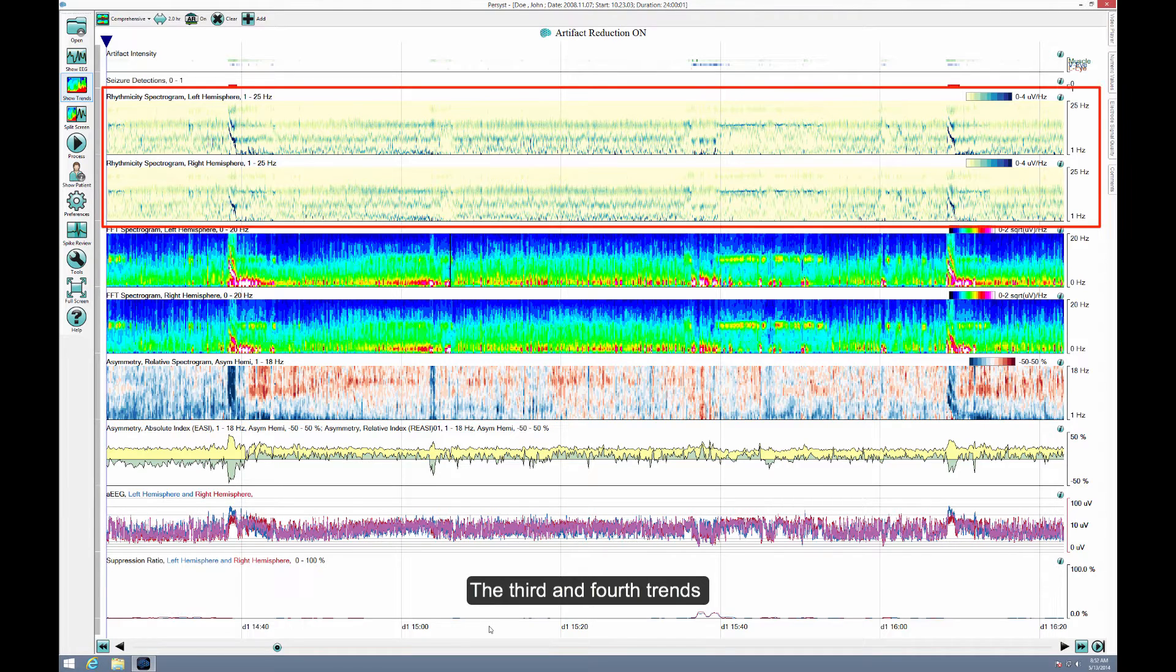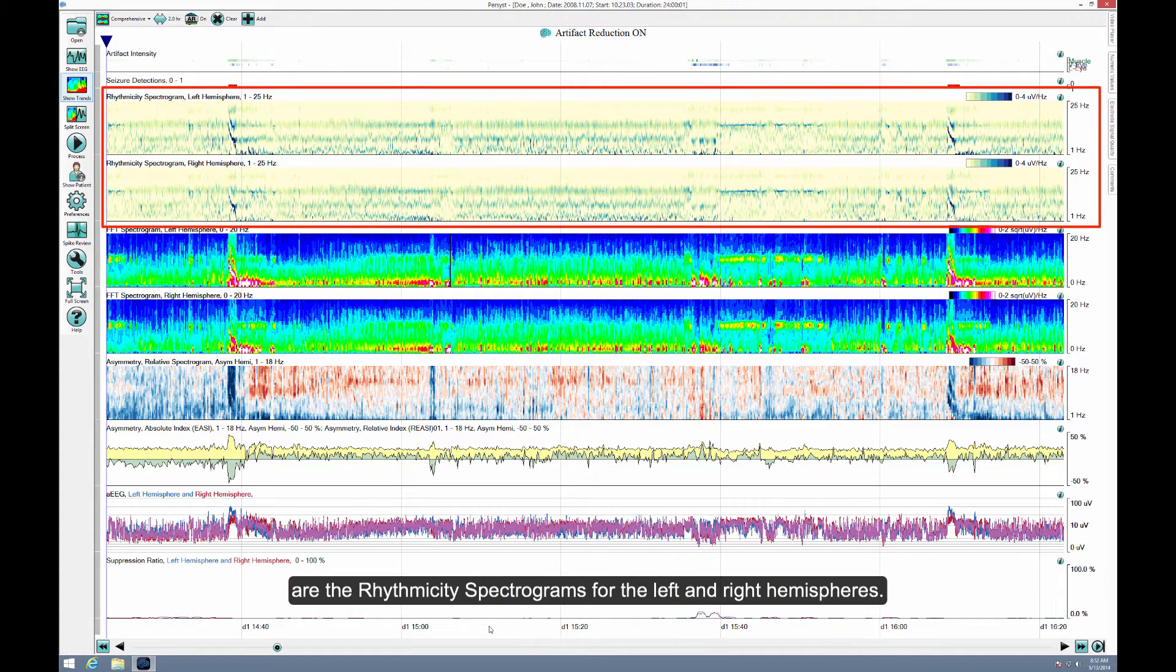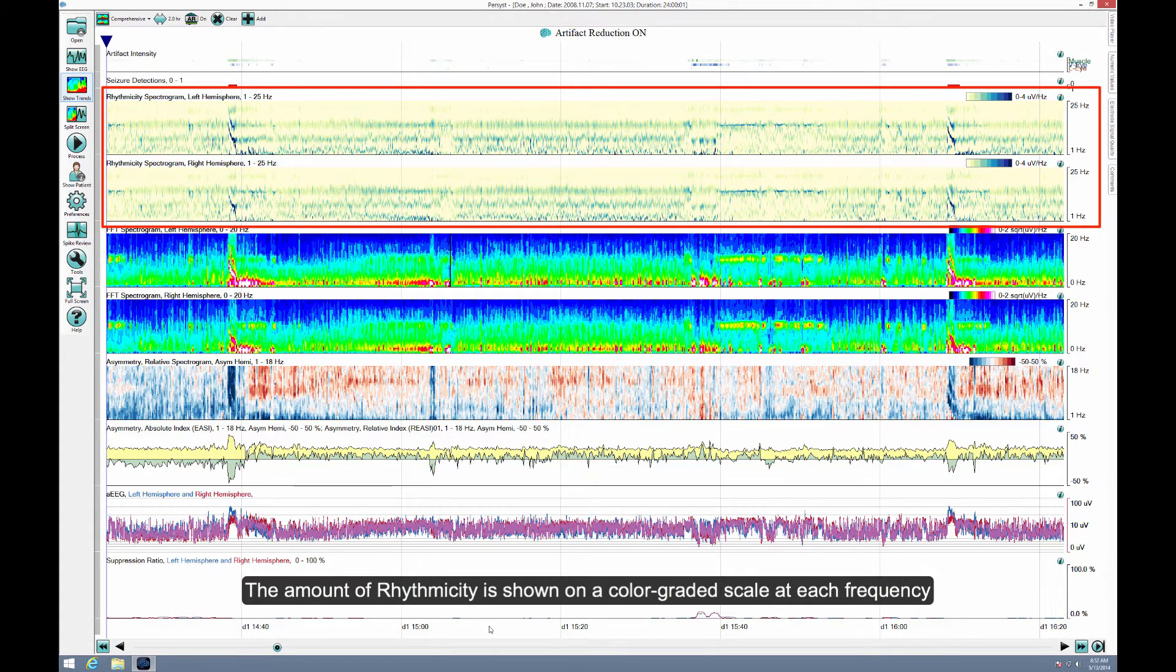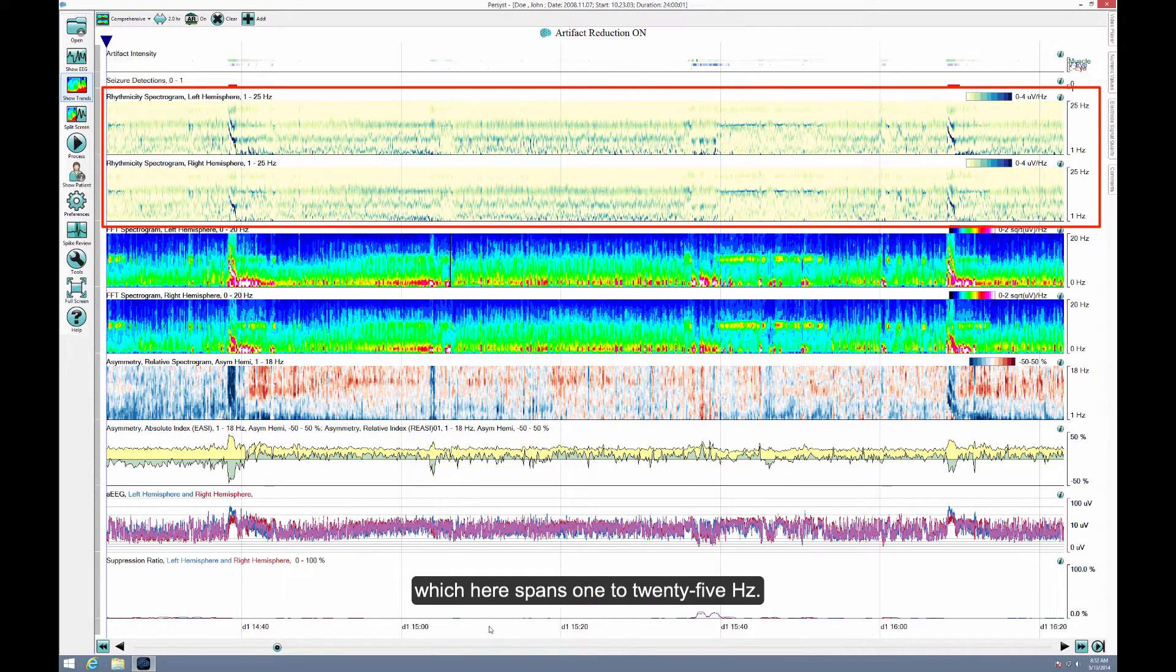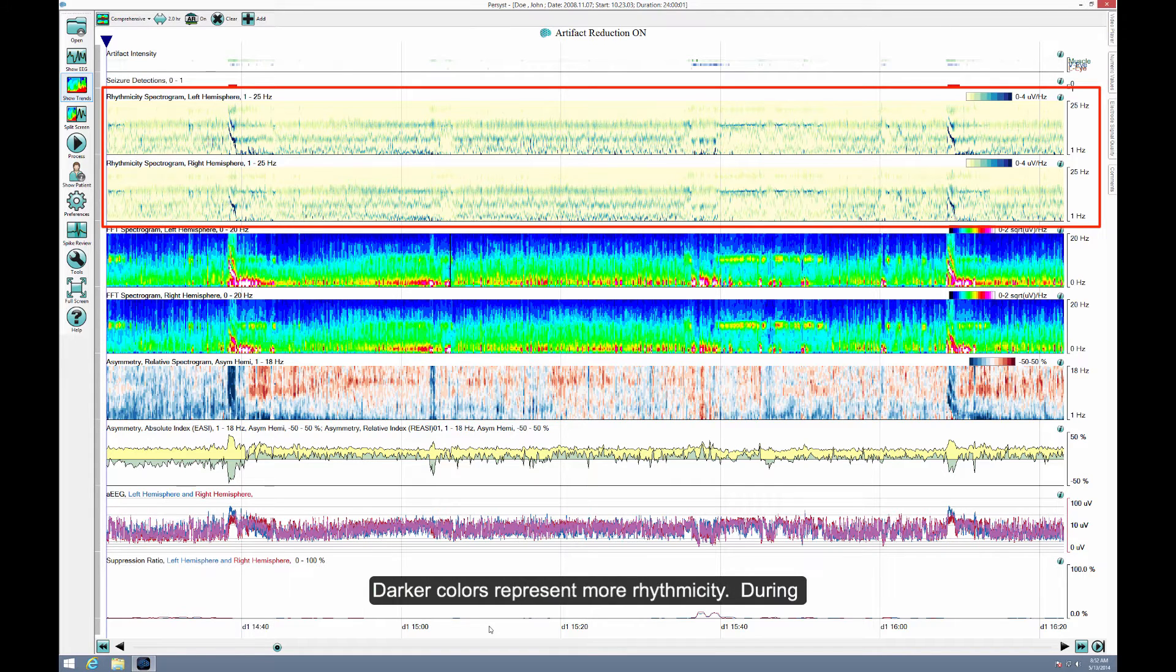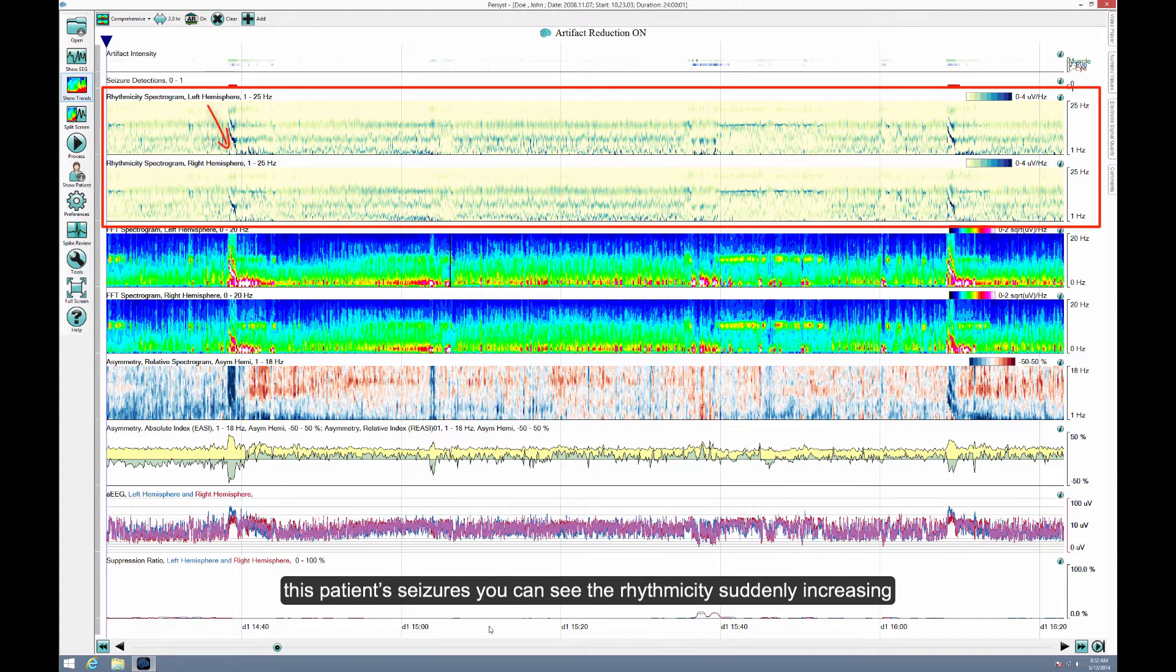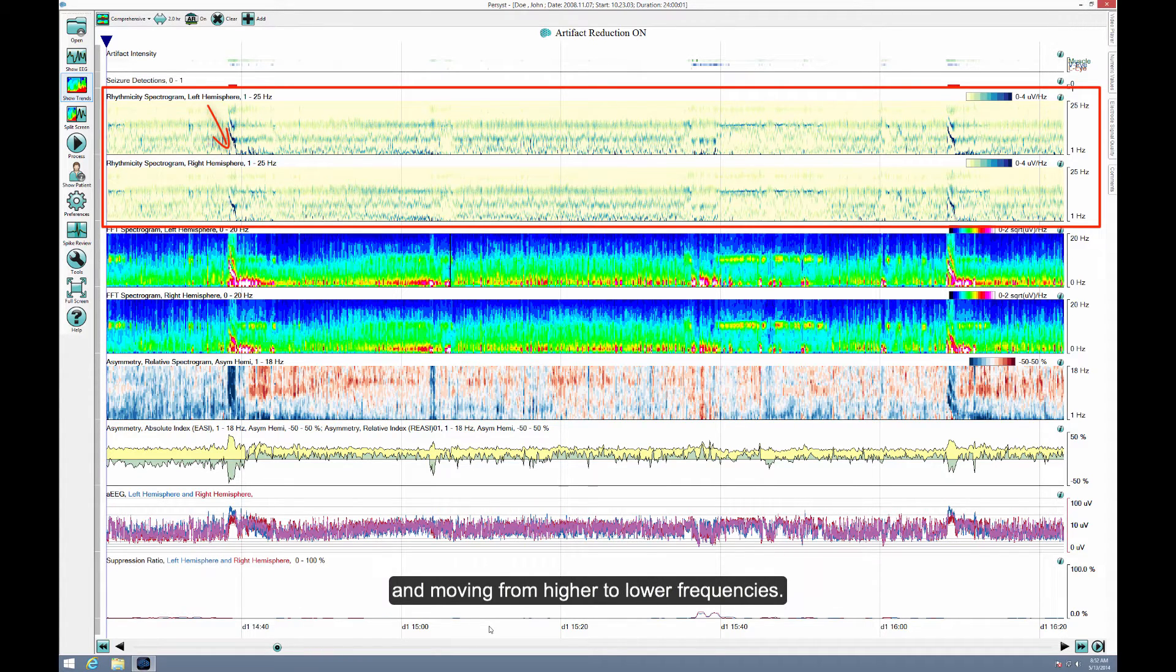The third and fourth trends are the Rhythmicity Spectrograms for the left and right hemispheres. The amount of Rhythmicity is shown on a color-graded scale at each frequency represented on the Y-axis, the vertical axis, which here spans 1 to 25 Hz. Darker colors represent more Rhythmicity. During this patient's seizures, you can see the Rhythmicity suddenly increasing and moving from higher to lower frequencies.